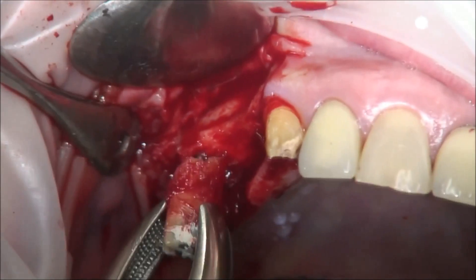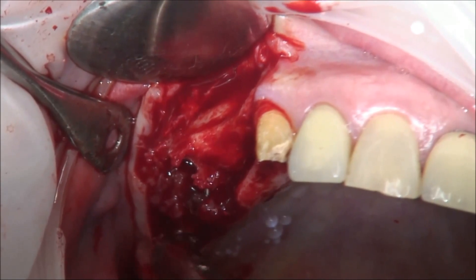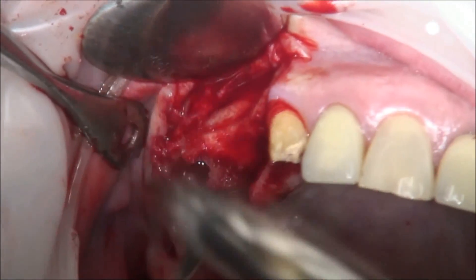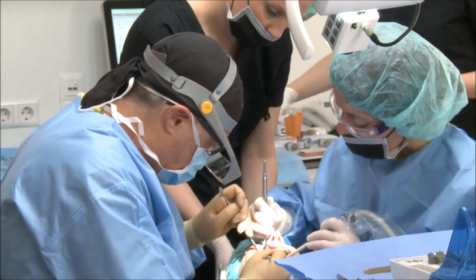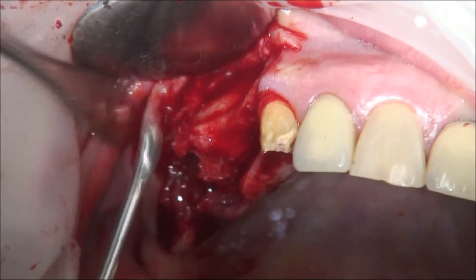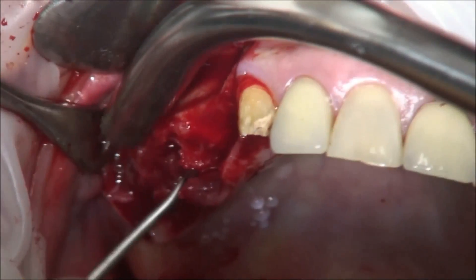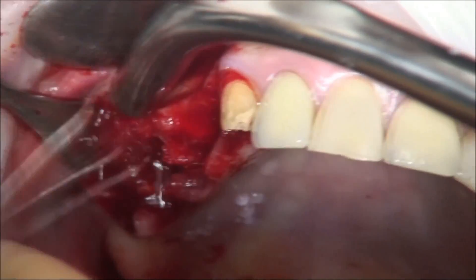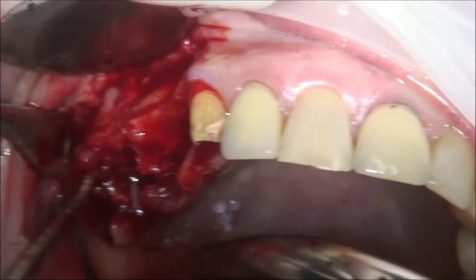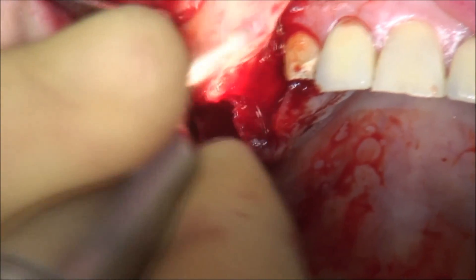Extraction of the second premolar — as you see, it had a very long titanium shaft without any reason. The fibrous tissue has to be removed. As you can see very nicely, the sinus is already open from the ridge side. So we will do a combined augmentation — filling the sinus from the ridge area and from the lateral wall area — along with cleaning the fibrous tissue.